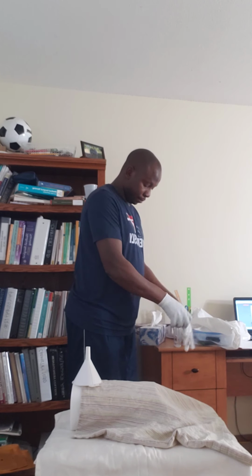Putting my gown on. This is tracheostomy care, so I have to be with the gown, I have to be with the gloves, I have to be with a mask, and I have to be with the face shield. Those things are PPE, personal protective equipment. Those have to be on when you are performing tracheostomy care. Now I'm pretending I'm putting the gown on.